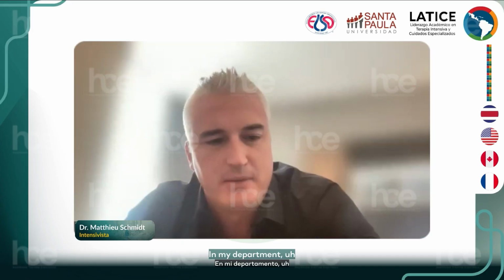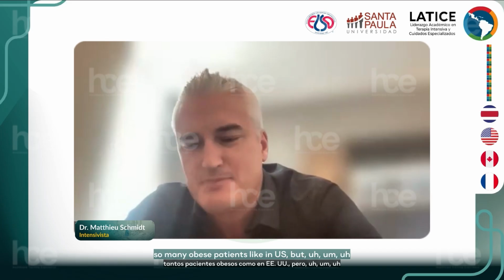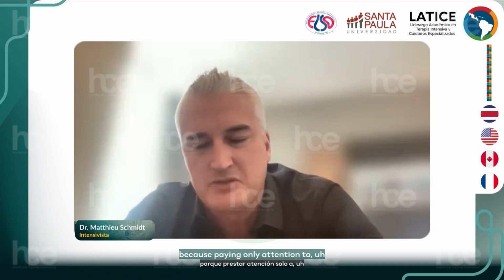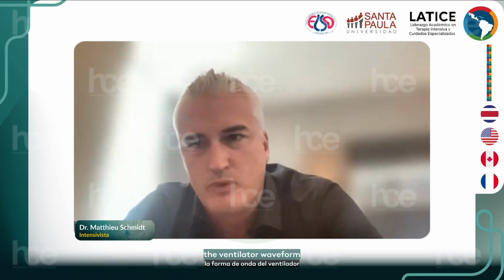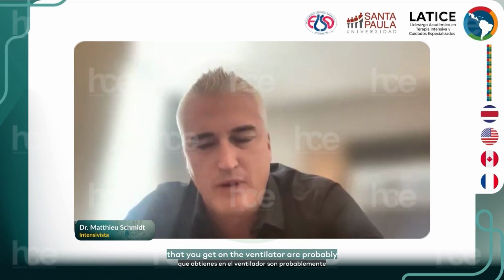Yes, in my department, specifically for this subpopulation, even if we don't have so many obese patients like in the US, we are prone to use esophageal pressure to monitor the respiratory mechanics, because paying attention only to the ventilator waveform and the information that you get on the ventilator is probably not enough in that subpopulation.